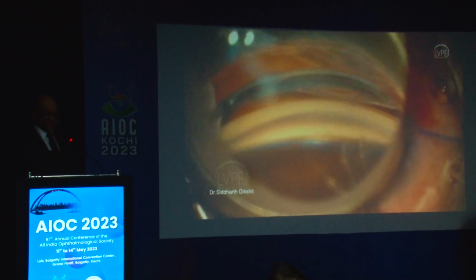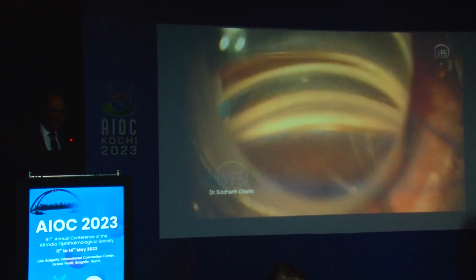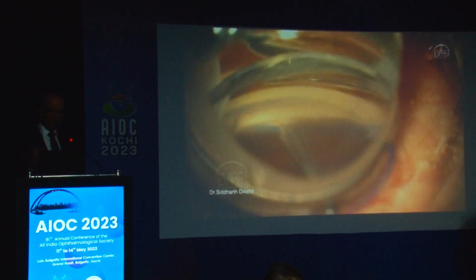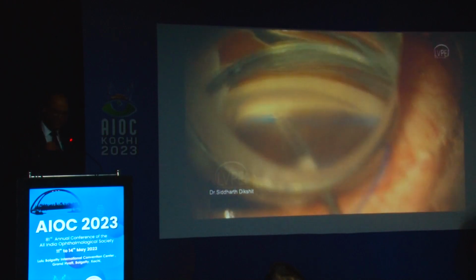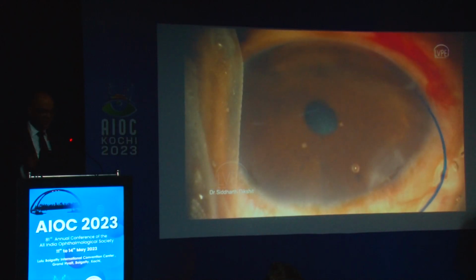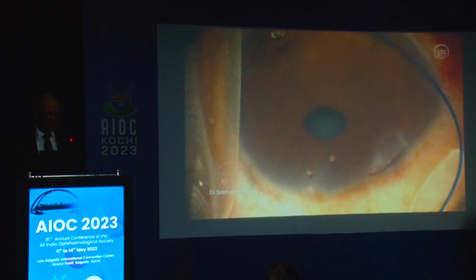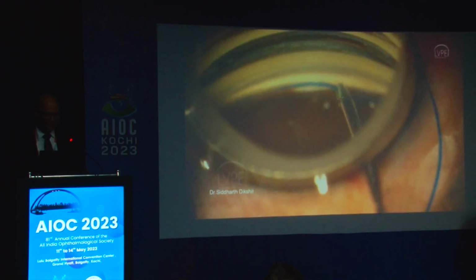The resistance does increase when the suture crosses the 180 degrees opposite side, because the vectors of the force change. You should be feeling some amount of resistance while you are doing it. It should not be resistance free. If there is too much resistance, then you can probably move on from 5-0 to 6-0, or if you are using 6-0 already, then a smaller tip of the suture, because you don't want to damage the angle and just come back without completing it.